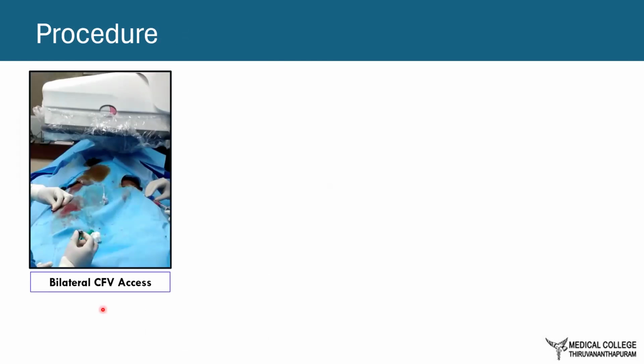In the initial five or six cases that we did with stimulation, cosyntropin stimulation is given about 30 minutes before the procedure. And this procedure has to be done as the first case in the morning, so we usually start at 8 o'clock. We started with cosyntropin infusion, and after 30 minutes, with the infusion continuously running, we take up the patient for the sampling.